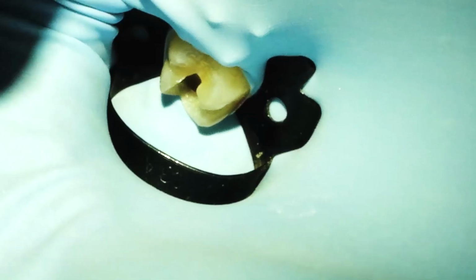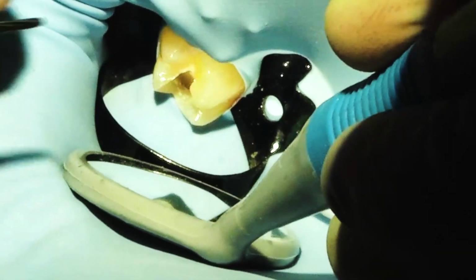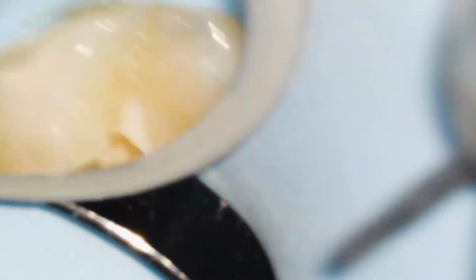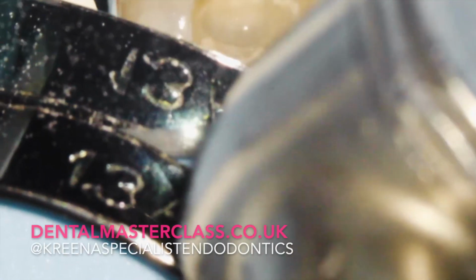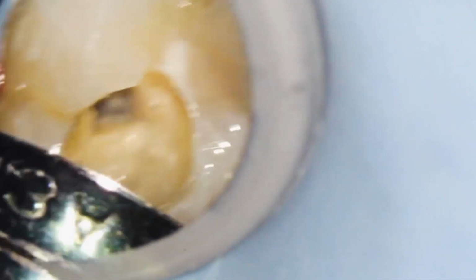So now that we've dropped into the pulp chamber, we don't really want to damage the floor of the pulp chamber, so we can use this to quite safely enlarge without causing any damage. So I can see here we've got the palatal canal. So we're going to have the mesiobuccal and distobuccal canal coming across on this side.